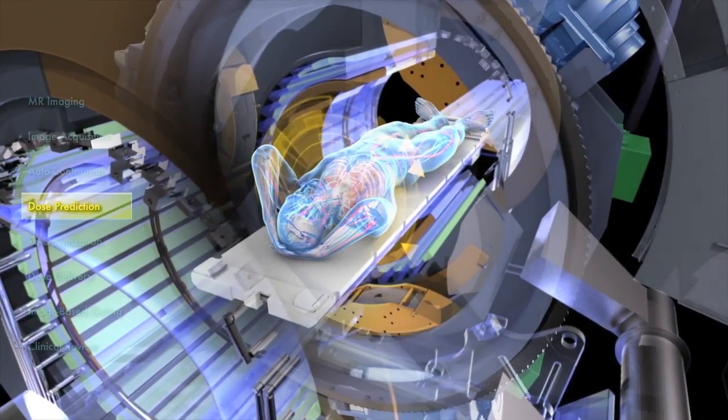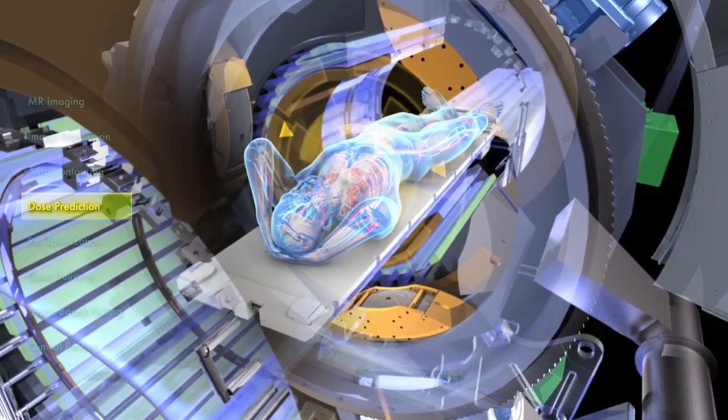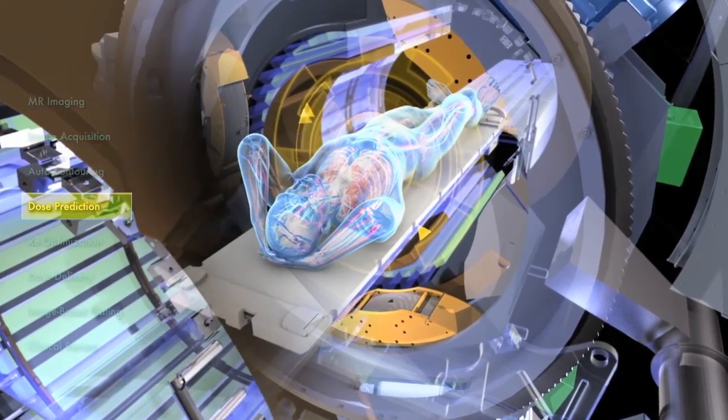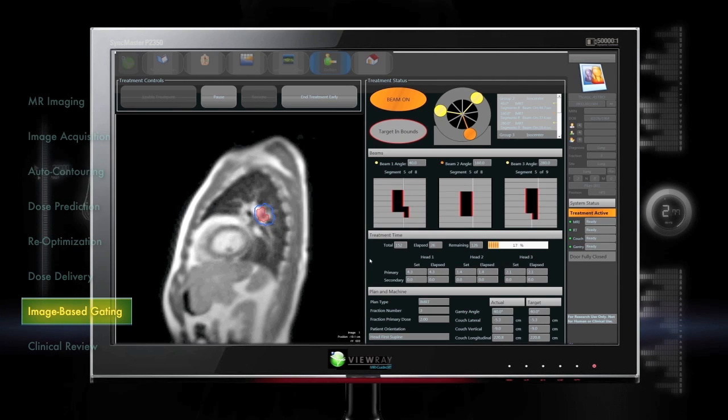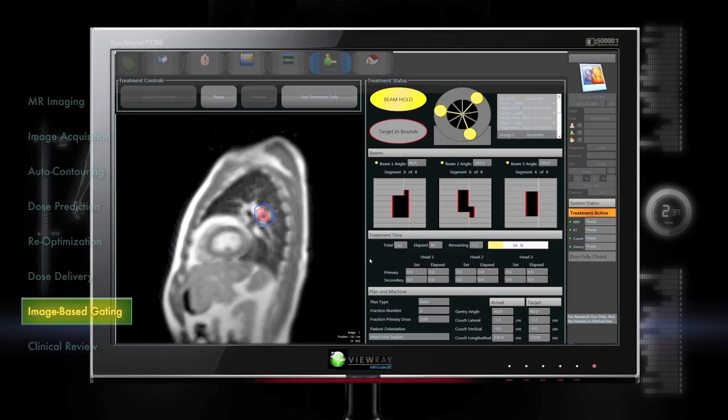Real-time imaging of both the target and surrounding organs means the physician knows precisely where the dose is being delivered as it's being delivered. Adaptive motion compensation software enables the system to target moving tissues during treatment.